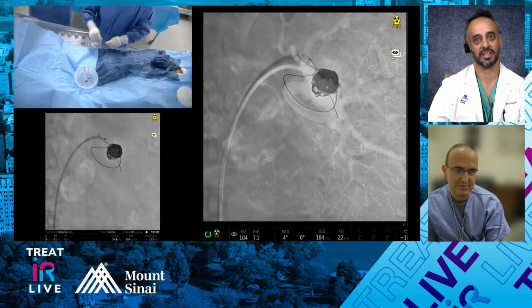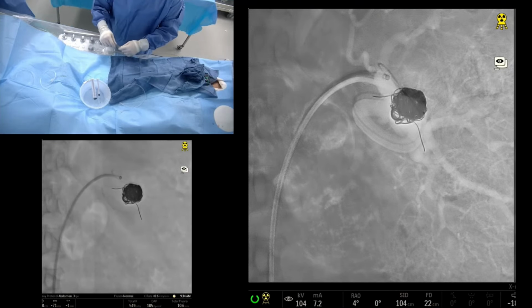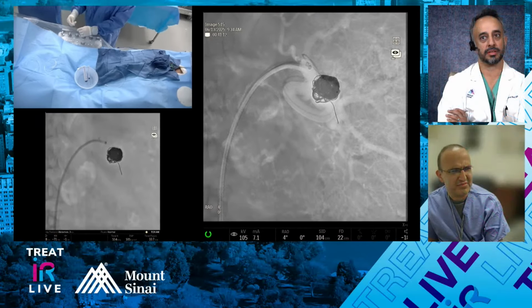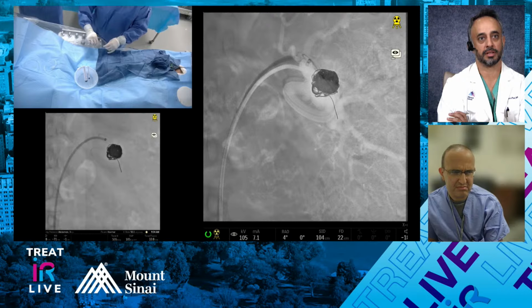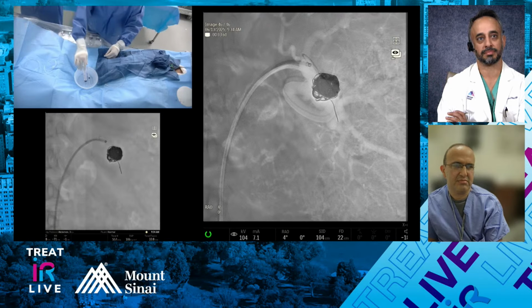All right, so I'm just pushing this 18, then we're going to downsize to like a 10 or a 12, and then probably just do the inflow, and we should be done. What's the smallest fiber size that you have? Good question. What is the smallest fiber size that we have? I think it comes in a 2x4, and then there's also the softs as well.